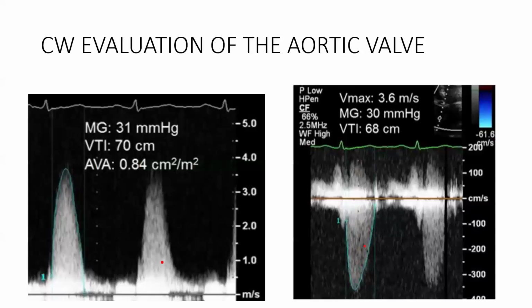Okay, Dr. Eugene, let me try. From the parameters you've shown, I think this is a low gradient AS. I think for this patient, it's an intermediate one.